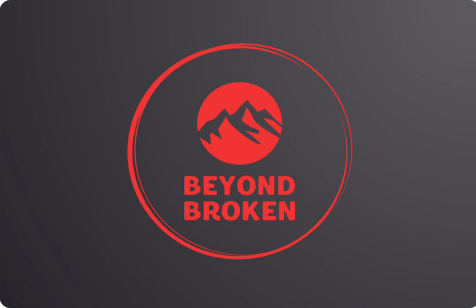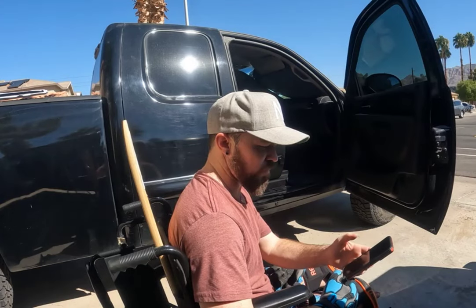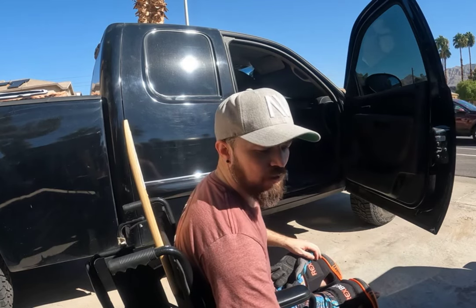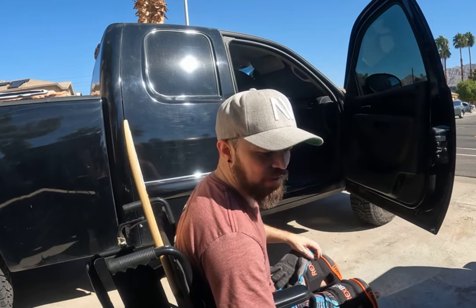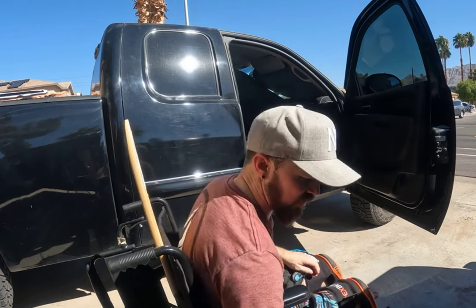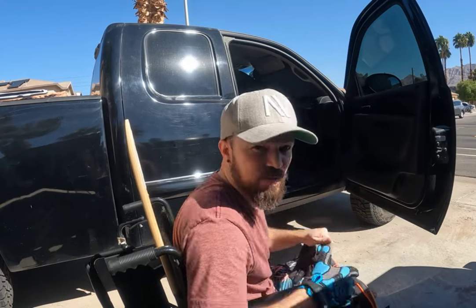Today's episode is how to transfer to a truck from a wheelchair. For this part of the video, I'm hoping this is a better angle for you guys to actually see exactly how I transfer into the truck. This would only be applicable if you're getting a ride to and from somewhere.